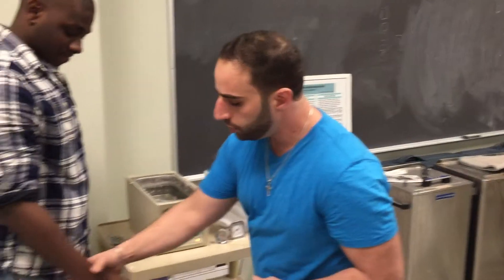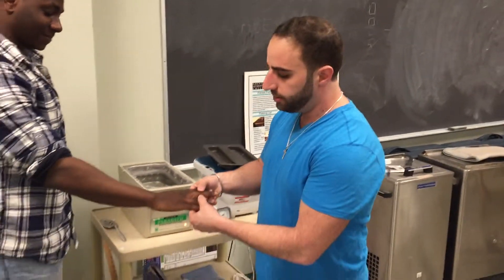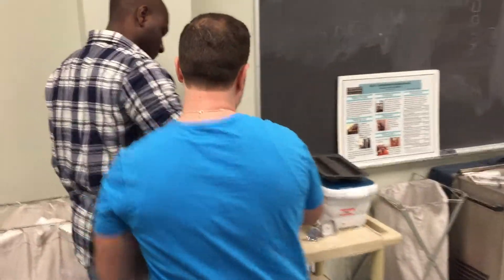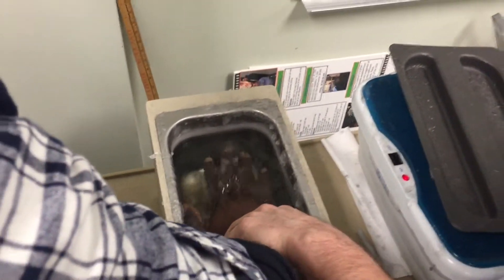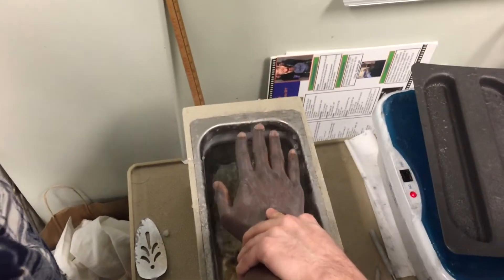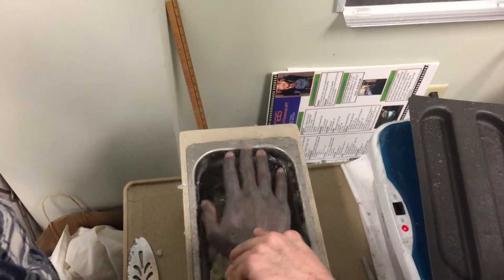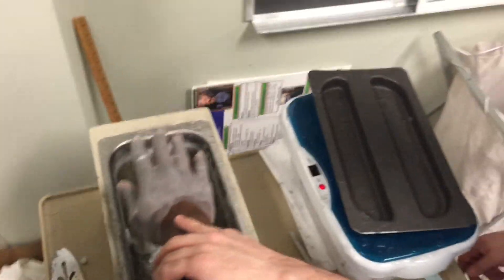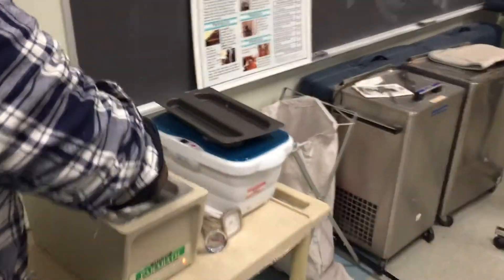Once we know the temperature is good, the patient should have their fingers slightly separated. We're going to dip the hand into the paraffin bath eight to ten times total. Here we go — one dip, and come up, continuing through to eight or ten dips.